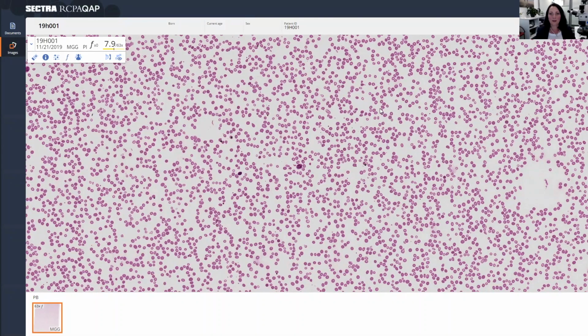Today we have case 19H001 from the RCPA website, e-cases, and this is the case of a 77-year-old man with a hemoglobin of 59, a white cell count of 3, and a platelet count of 61. Let me share my screen. Okay, so hemoglobin of 59, white cell count of 3, platelet count of 61, and let's see what the MCV is, because that will really help us direct where we're going.